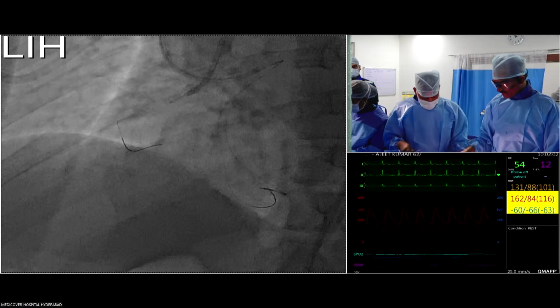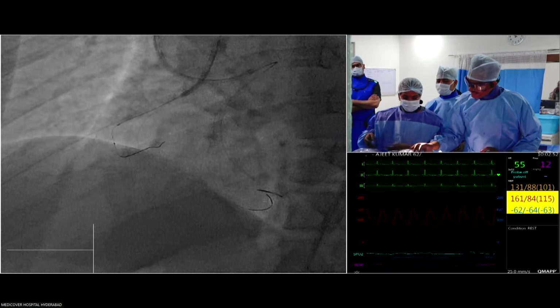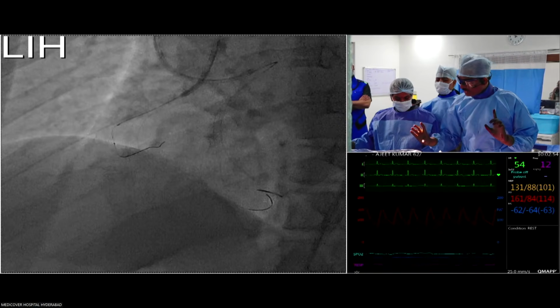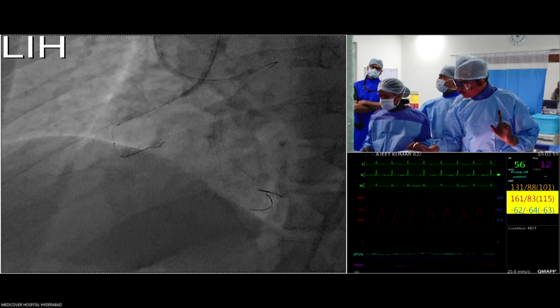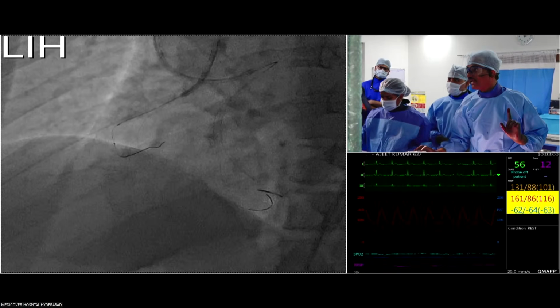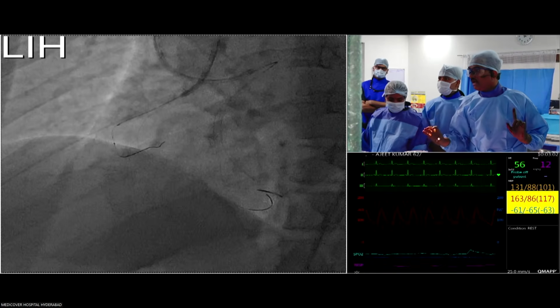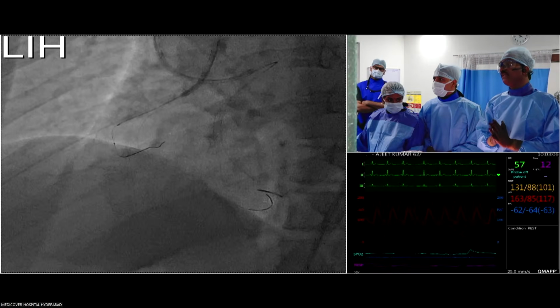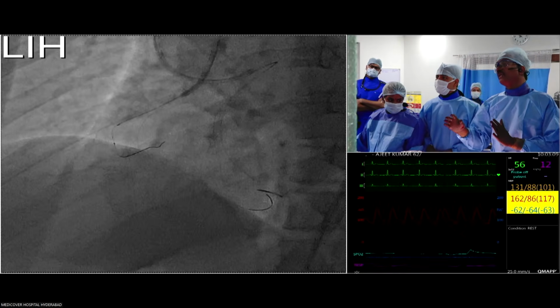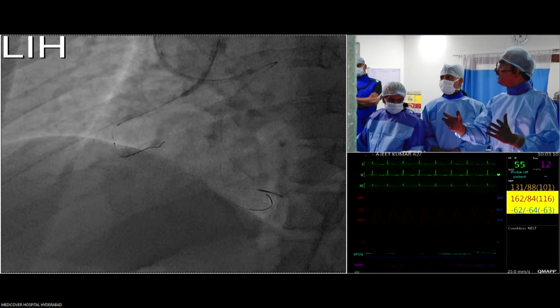So that was the problem. The distal vessel is not clearly visible even in dual injection. In that case, even if I do IVUS-guided cap puncture, it's very difficult for me to understand whether my antegrade wire is in the distal true lumen or not, because primarily that vessel is not visible.